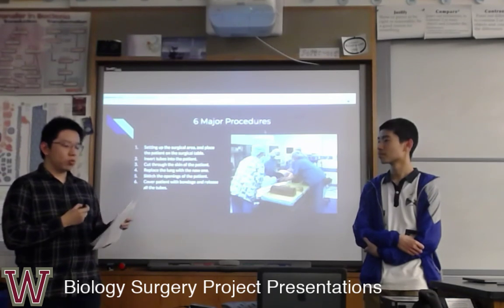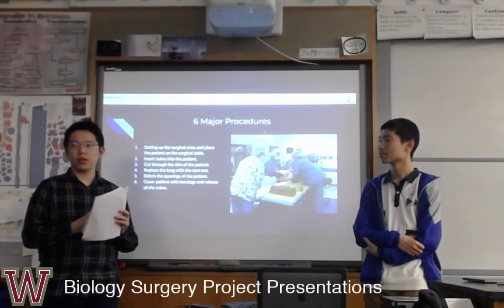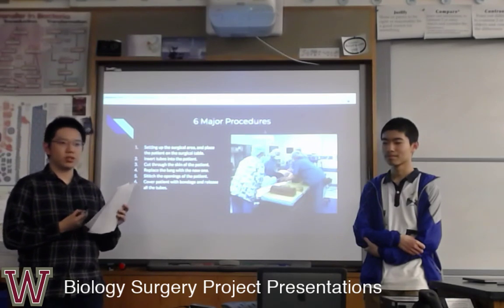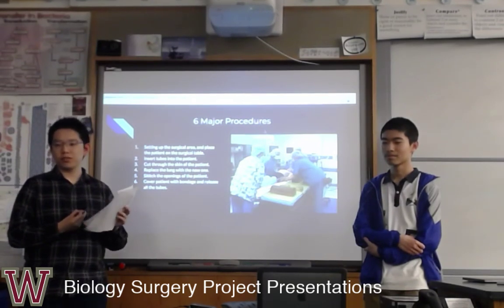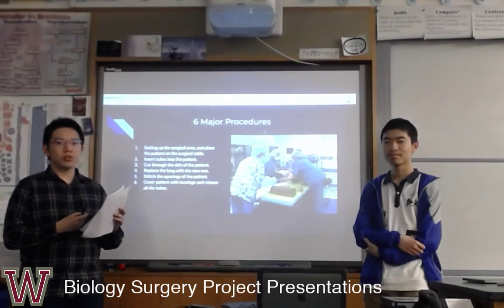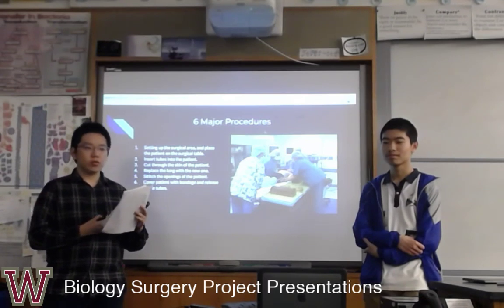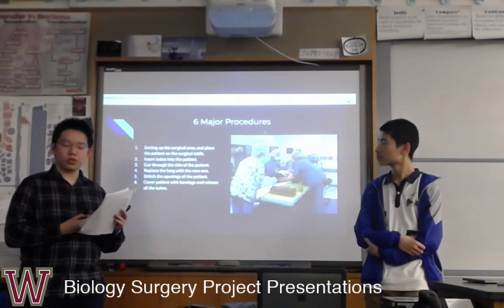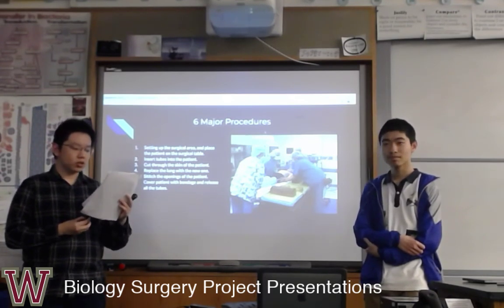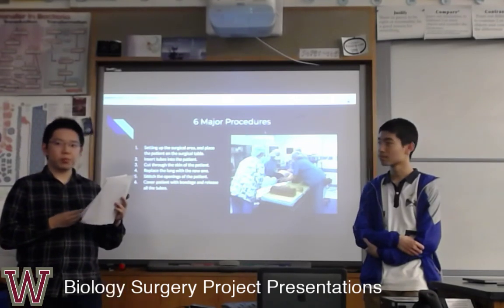So during our surgery project, we don't have a human being to do the surgery, so we use a pig instead of the man. We first need to incise the skin and the muscles of the pig's tummy, and then open the piggy's tummy, and then we find the lung we need to replace.